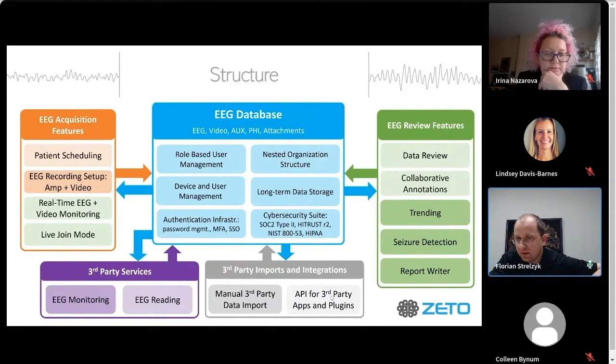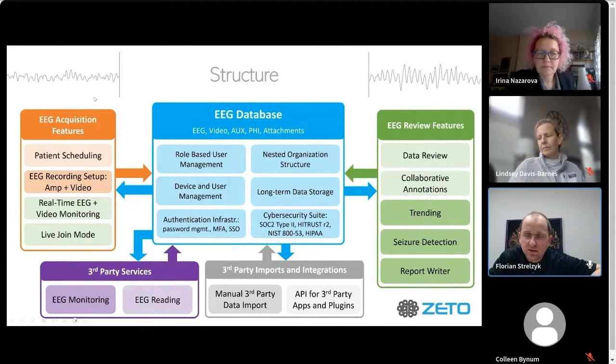These are not part of the standard installation package of our cloud, so many of you would not even see them. But if you are collaborating with researchers and they want to put their own code or custom analytics on our cloud, we have the ability to do so. The Zeto Cloud is a standalone product that we customarily offer along with our Zeto hardware, but you can completely use it without the hardware also.